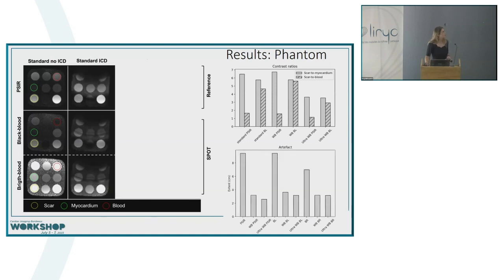We then applied these techniques again when we taped the ICD on the side without any wideband, and as you can see, we see clearly hyper-intensity artifacts on the 3 images, but also ripple artifacts. So these are some bands on the image. For the artifact extent, it was up to 9 centimeters, which is quite huge. Usually the ICD is taped at 10 centimeters around from the heart, can be also less.